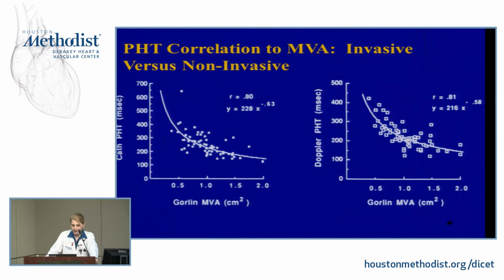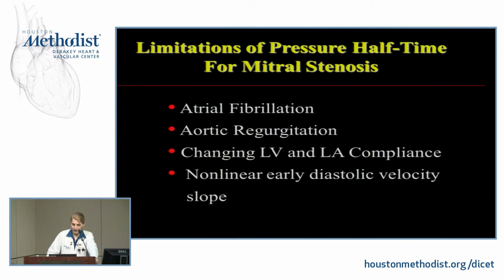And this is just looking at the original data, comparing how accurate that is, non-invasively to invasively determined measurements. And you can see that the correlations were very, very similar. Now, there are limitations for the pressure half-time for mitral stenosis.